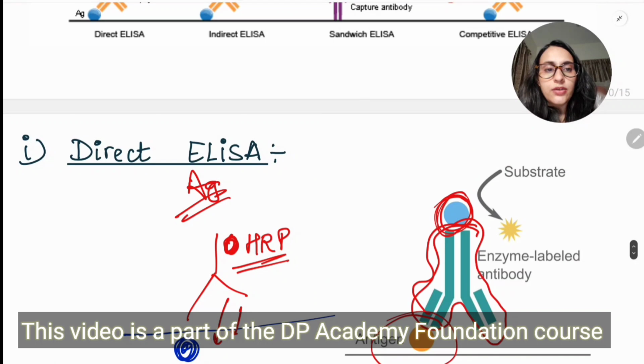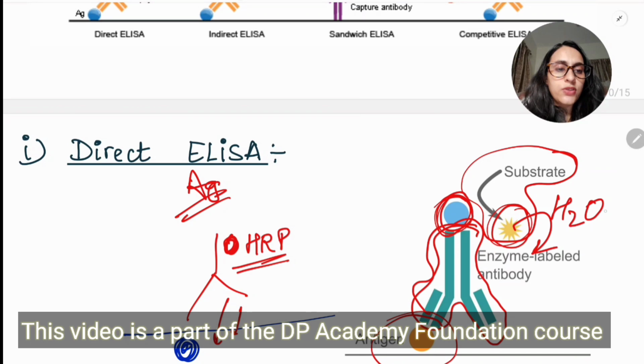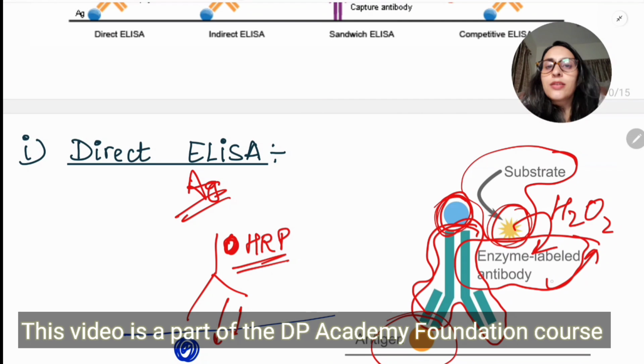And here we have a substrate. This substrate, when it combines with the enzyme, substrate is what? Hydrogen peroxide. When it is combined with the enzyme-labeled antibody, the enzyme is going to break this hydrogen peroxide because the enzyme is peroxidase, horseradish peroxidase, this HRP enzyme.